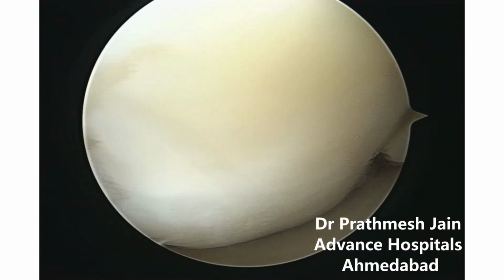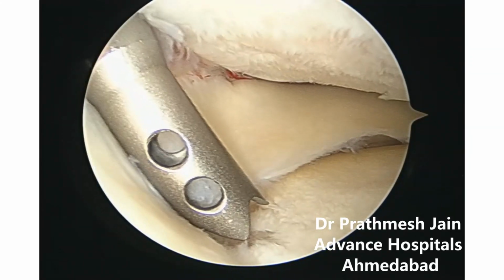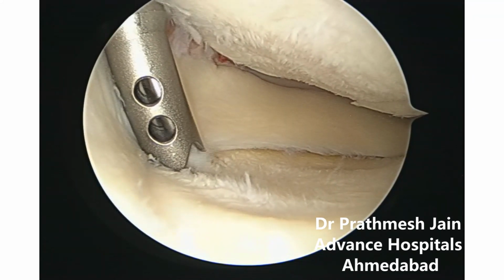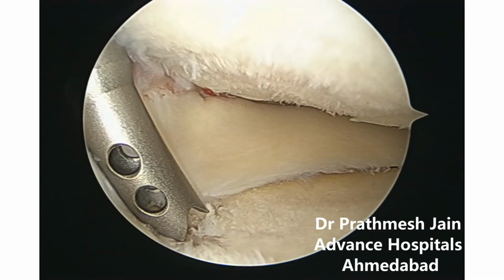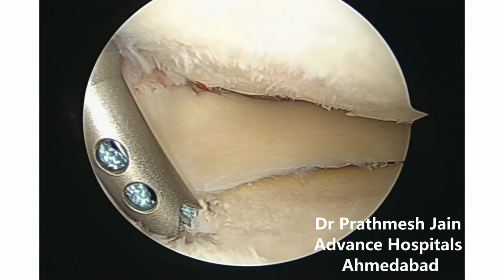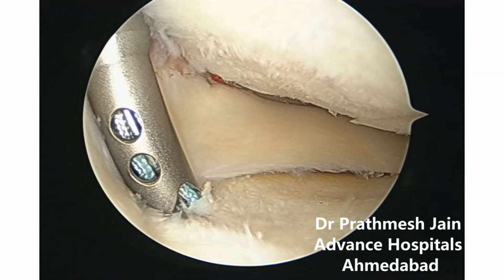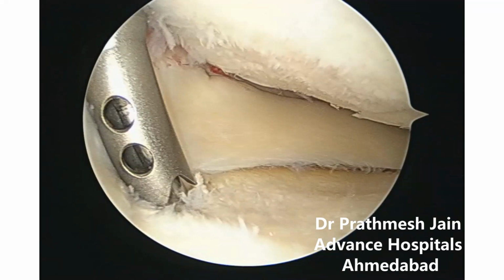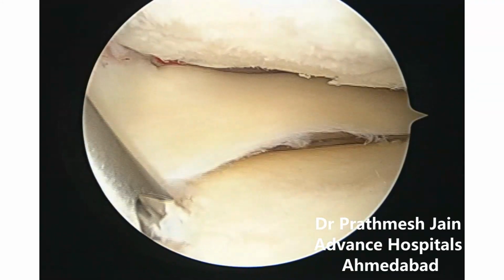So we will repair the meniscus extrusion with a suture anchor on the anterior aspect. Here what we will do, we are using a suture fix all-suture anchor on the medial aspect of the tibial plateau, and this anchor will go into the tibial plateau, and this will be used as the suture for reduction of meniscus extrusion on the anterior part. So this is a bipolar repair. We repair both the anterior and the posterior part to reduce the extrusion.